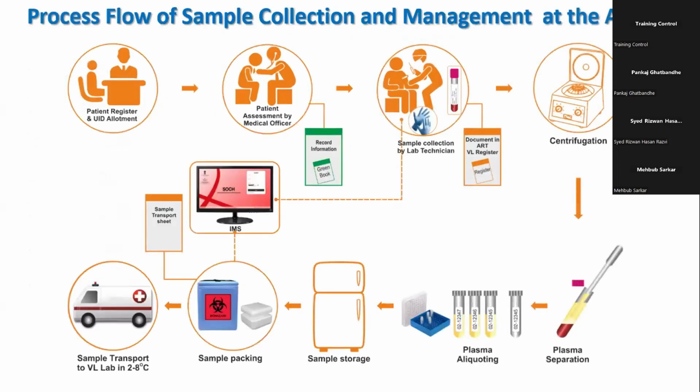So the routine flow of the patient is, when the patient comes, they get registered, they see the medical officer, and then the medical officer requests a test, either CD4 or viral load. Then the patient goes to the lab or phlebotomist wherever the blood is collected, and blood has to be collected at that place, and then simultaneously an entry has to be made into IIMS, Integrated Information Management System, which is nothing but your SOCH, the day-to-day activity.